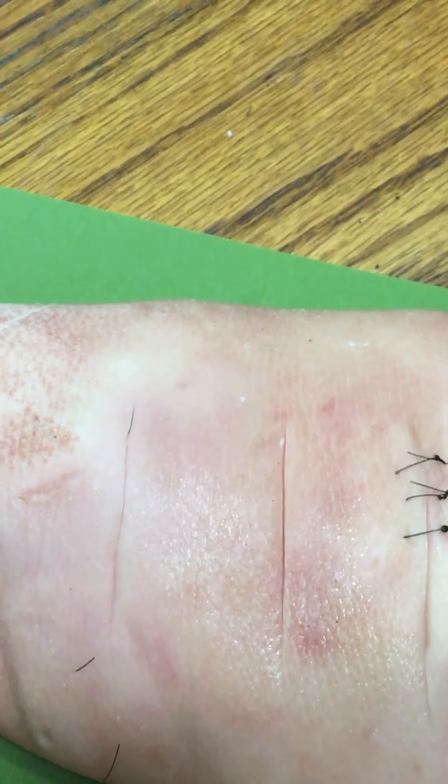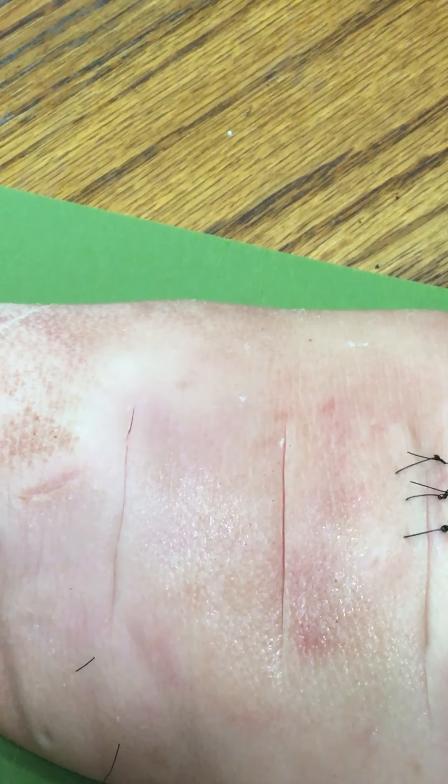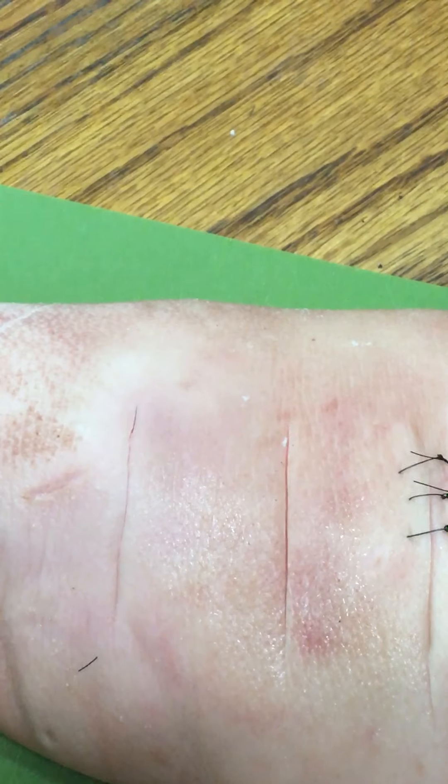This will be a demonstration of a vertical mattress suture. You want to use a vertical mattress suture when you want to close a deep layer and a shallow layer at the same time.